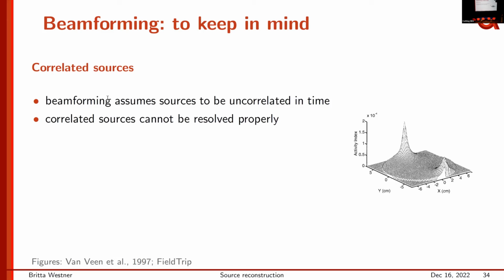So I think for the co-registration part, I just more or less talked about the bare minimum you would do, taking those 3 points. And that is true. Of course, if one of those points is a little off, your transform will be off as well. So what we usually would also do, for example, with MEG is you get a shape of the head with this hardware stylus that you use to mark those points, to get the coordinates of those points.